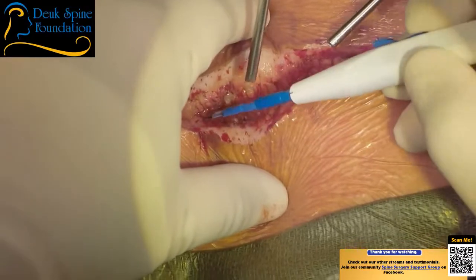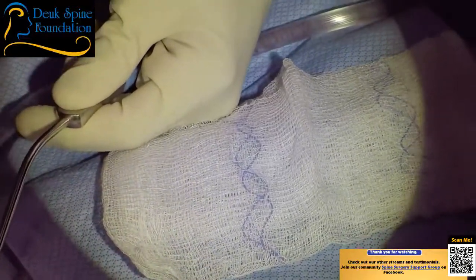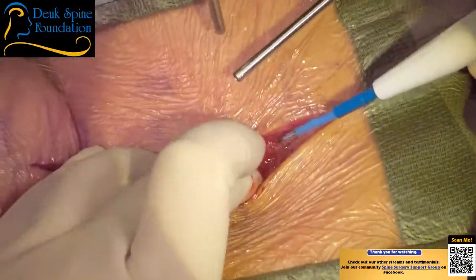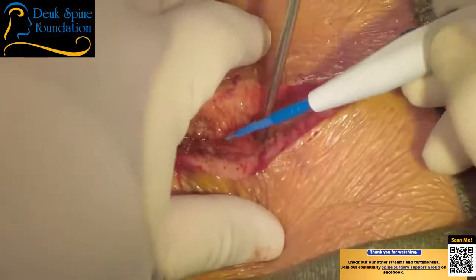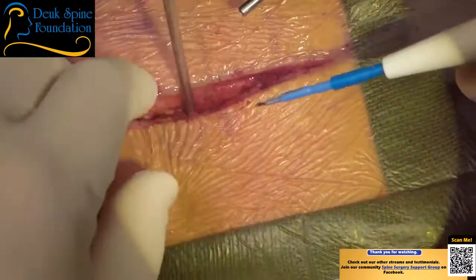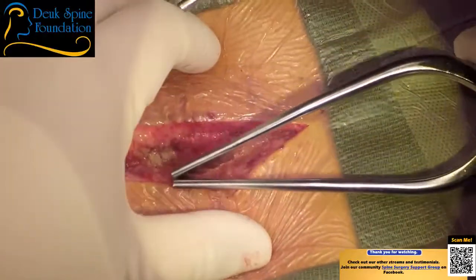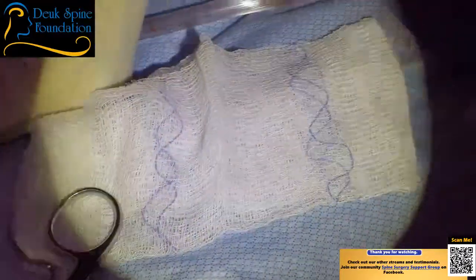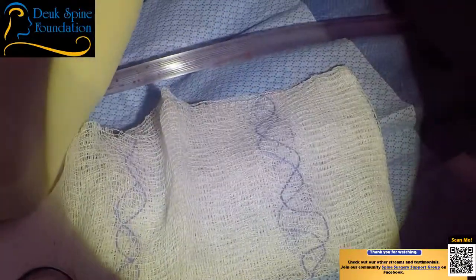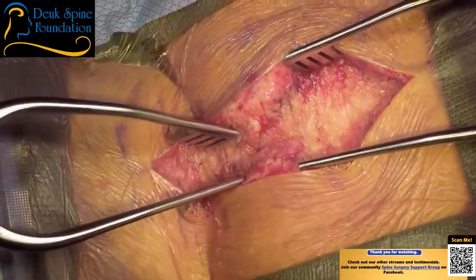and I've seen surgeons get lost doing this surgery, believe it or not. And the reason they get lost is they don't know where the spinous process is. The most important thing is to just go down on the spinous process, okay? When you have a heavier patient, you want to really be careful not to miss the spine. I chuckle about it, but only because I've seen it happen. Not with me, but with other surgeons, where they're looking at the operating room floor, which is bad, right? So that means they really missed the spine. And it's easy to do.